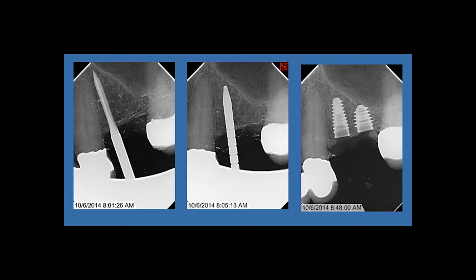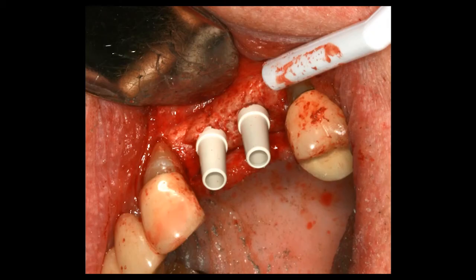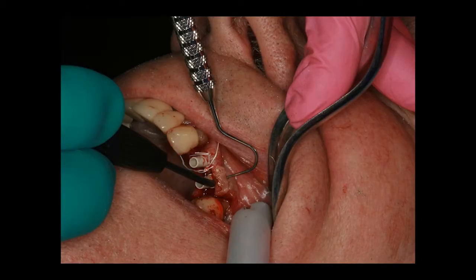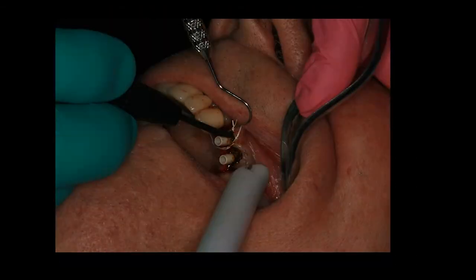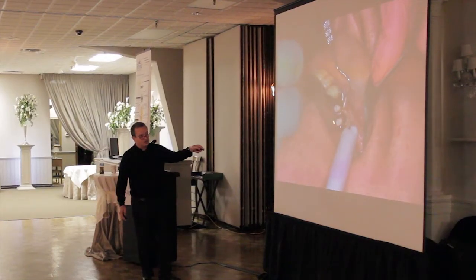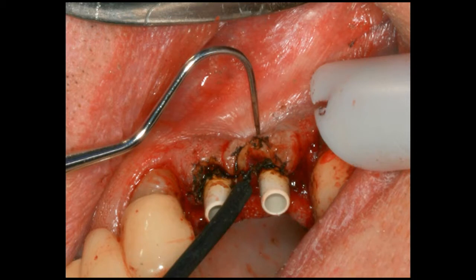Here's showing my initial pilot drill — we're a little off course, so we take the handheld osteotome to straighten that out, place that implant, then go ahead and place the second one. This patient insisted on having teeth during the healing phase, which many patients do. So we've got our PEEK abutments in place. We're going to suture everything up around these things, then fill each one with Teflon and flowable composite. I can use electrosurgery here because I'm running up against plastic and not touching the implant.